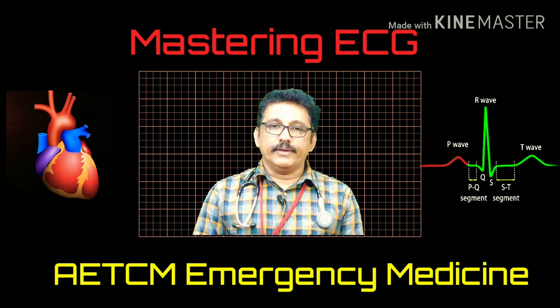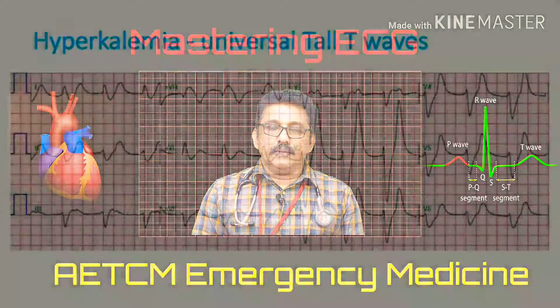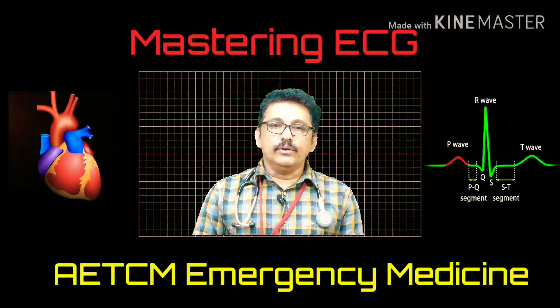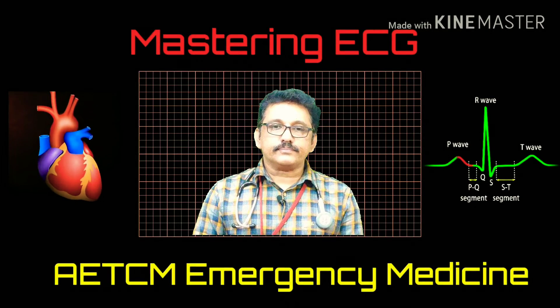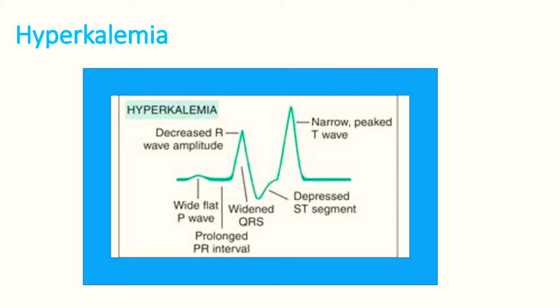Hyperkalemia is classically seen in renal failure. In a hyperkalemia ECG, most leads show very tall T-waves, the QRS complex is wide, and there may be no P-wave or the PR interval may be prolonged. So wide QRS complex with very tall T-waves is an indication for hyperkalemia. In this ECG, you can see the T-wave is taller than the QRS complex — it is very narrow and peaked, which is classically seen in hyperkalemia.